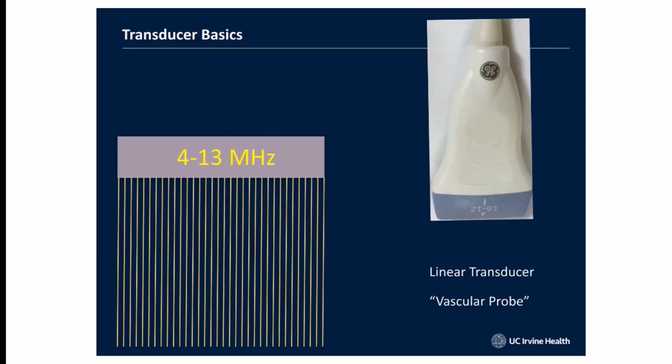Thyroid ultrasound is also done with this kind of transducer, since the thyroid lies directly beneath the skin. With this type of transducer, we're getting the areas closer to the skin. We're not seeing the deep reflections from inside the abdomen.